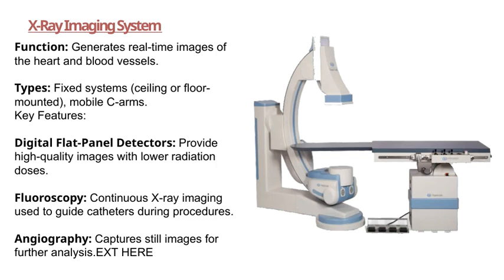Then, there's fluoroscopy, which is essentially continuous X-ray imaging used to guide catheters during procedures. It allows for real-time visualization, making complex interventions safer and more precise. Finally, angiography is another critical component. It captures still images for detailed analysis after the procedure or for diagnostic purposes.